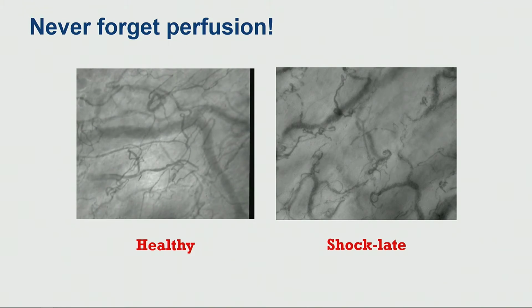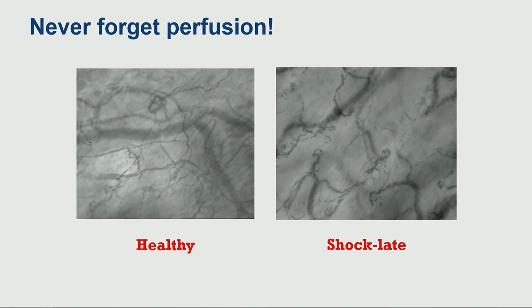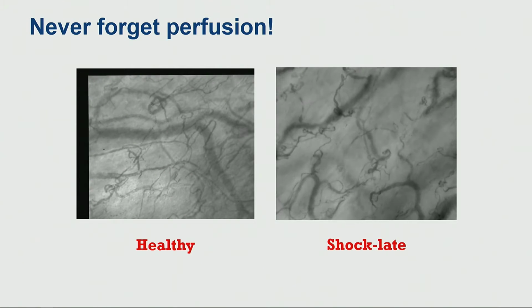Okay, here we go. So what you can see, this is sublingual microcirculation, healthy sublingual microcirculation, lots of good capillary flow and lots of brisk capillary flow. But on the other side, you see a patient on 3 vasopressors. MAP is still 65, but you see how the microcapillaries drop out here, and you see how sluggish the flow is. These were real patients that I have personally done these microcirculation studies on, and we've seen these obvious differences.